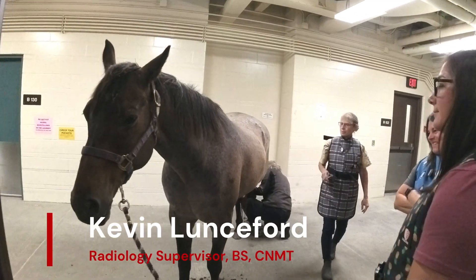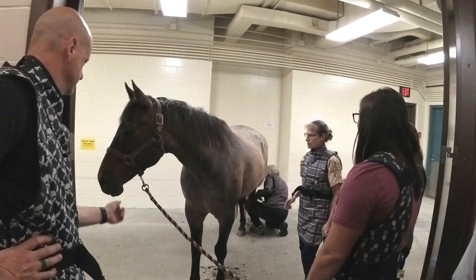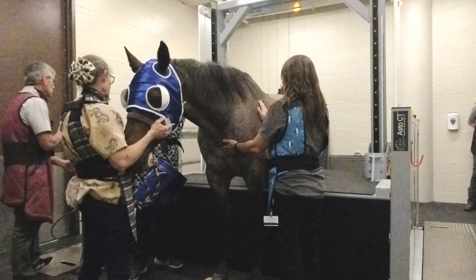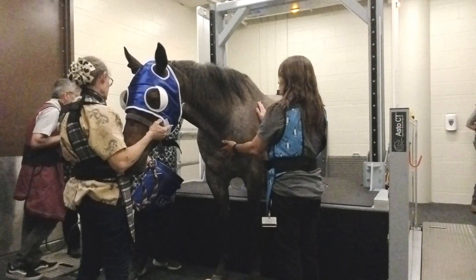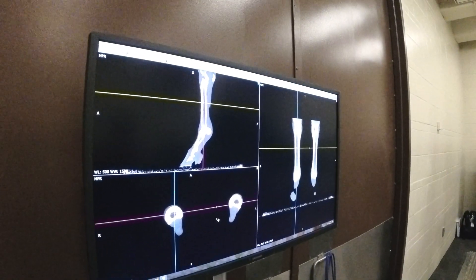Just starting to learn some of the ins and outs on how to use the system. I think the more we use it, the more comfortable we'll get. Probably the quality of what we're able to acquire will become very consistent. The scanner is very easy to use and the pictures are remarkable.